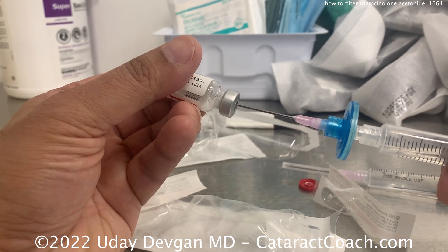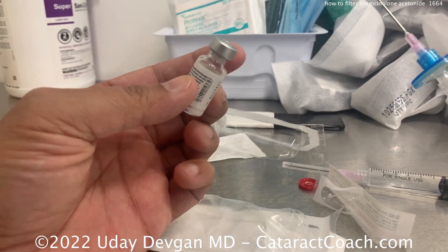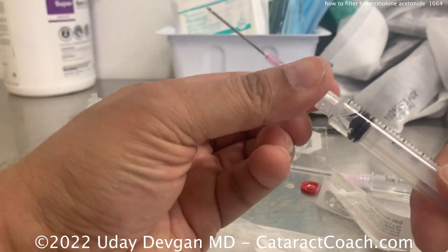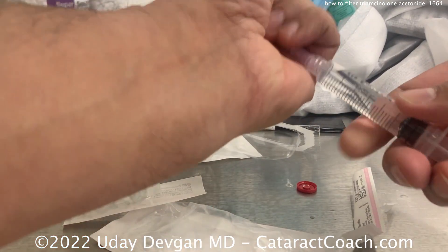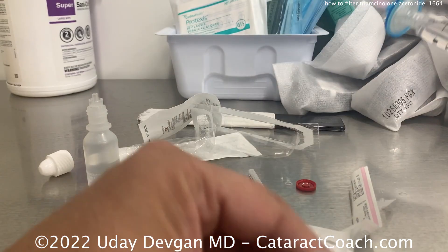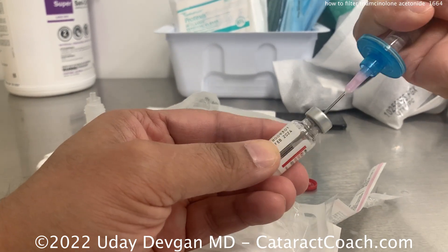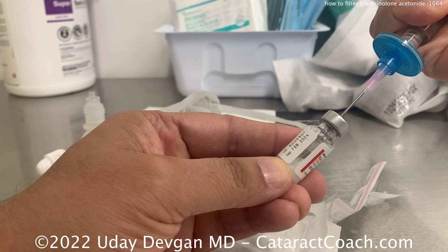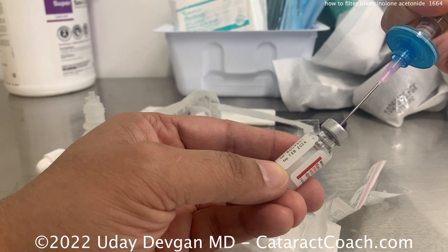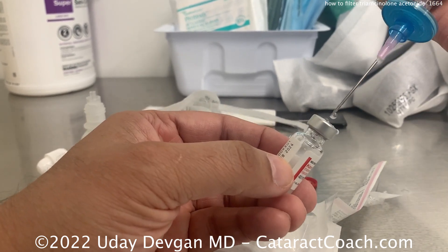Now we've got a complete removal of the Triamcinolone particles from the original fluid. We can get rid of the syringe that's on there right now, because that has the original liquid with the preservatives — throw that away. Now put our BSS on and resuspend these particles in BSS. You can put in 1 cc if you want the same concentration; if you want less, put in 2 cc and it'll be 20 mg per ml. And then that's it — you're done. Keep this sterile and you can hand it off.